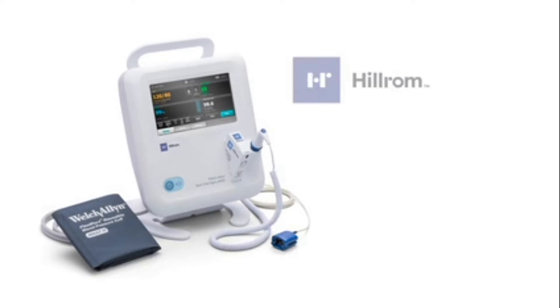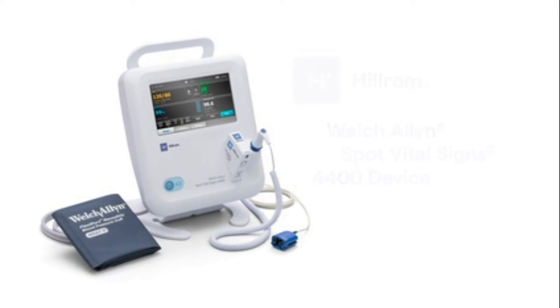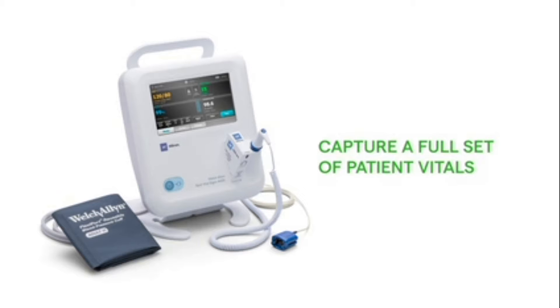Experience simple, accurate vitals capture with the Welch Allen Spot Vital Signs 4400 device from Hillrom. Today, we'll review how to capture a full set of patient vitals with the Spot Vital Signs 4400 device.